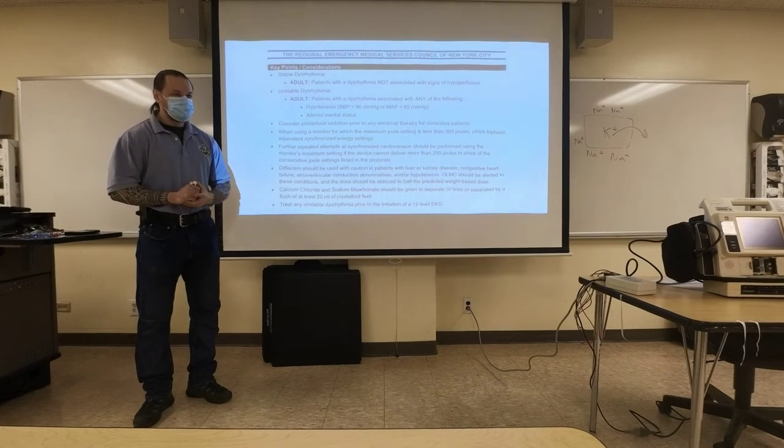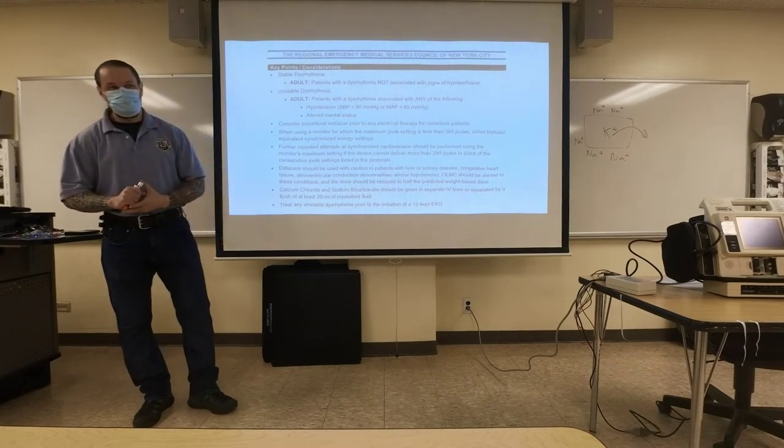They want you to treat the dysrhythmia before you get a 12-lead. And you're not really getting one before treatment. Usually that was a safety feature implemented.